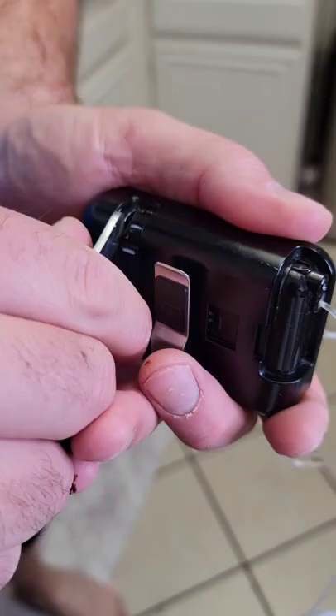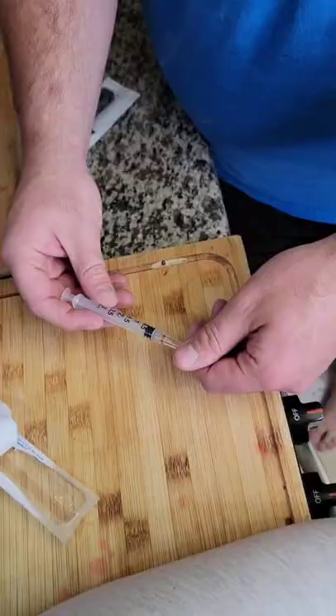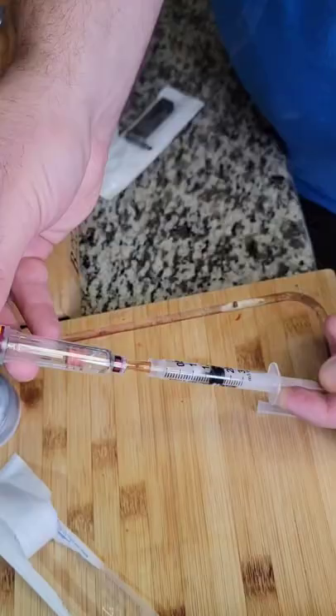First, take out her site, clean it up, and pop the insulin cartridge out of her pump. Then we're gonna put the syringe together and withdraw insulin from the insulin pen.